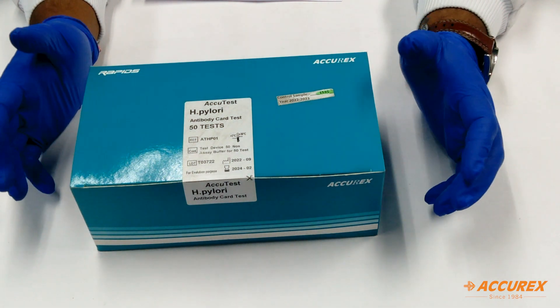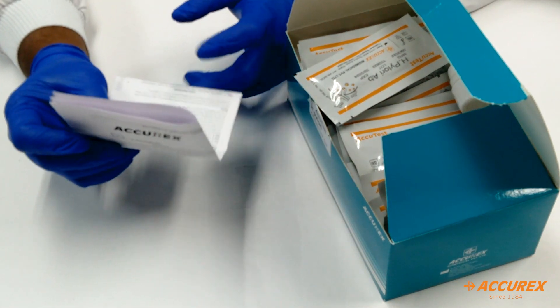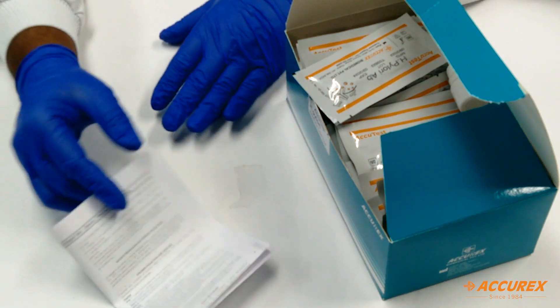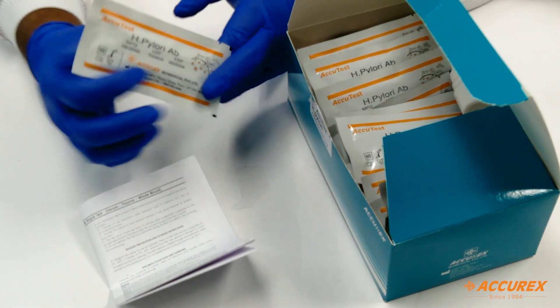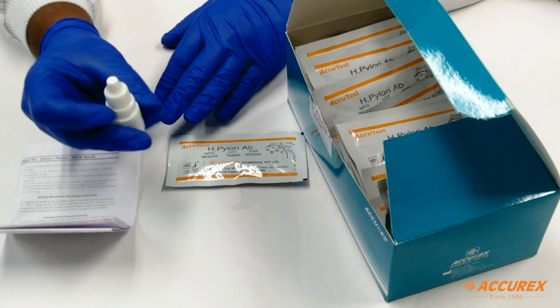Always wear gloves to avoid the infection spreading. The components which come inside the box are a pack insert which we can use for reference during the process, a test card with a dropper, and a buffer.